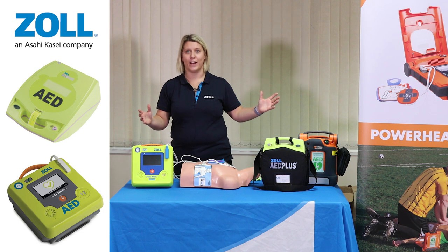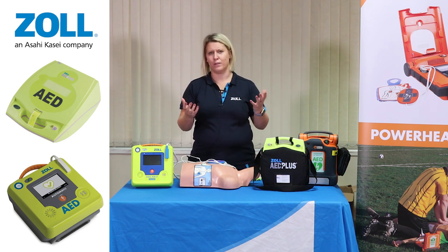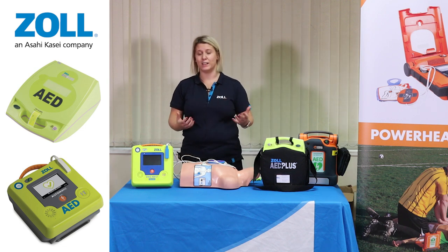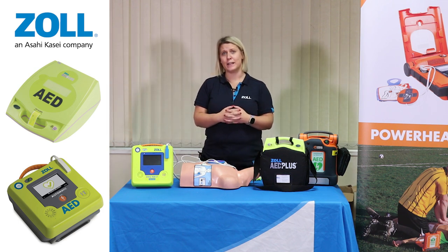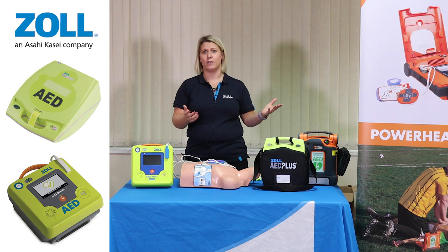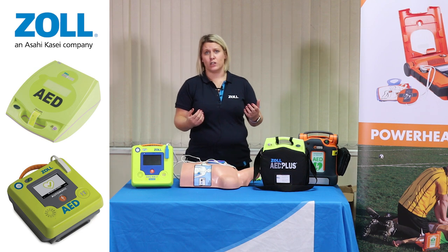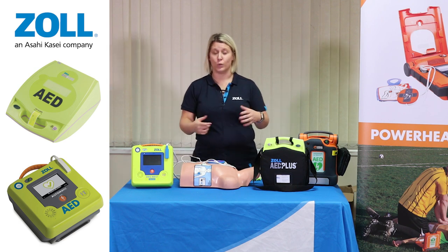What joins all of our devices together is the technology called real CPR feedback. Research indicates that clinically we're looking for 100 to 120 beats per minute if someone is in sudden cardiac arrest to increase their chance of survival. We're also looking for a compression depth of five to six centimetres. Without guidance it would be like driving a car without a speedometer. What our devices will do is provide you with that information so you can make sure that you are pushing harder and ensuring that the rate is being met to increase their chances of survival.